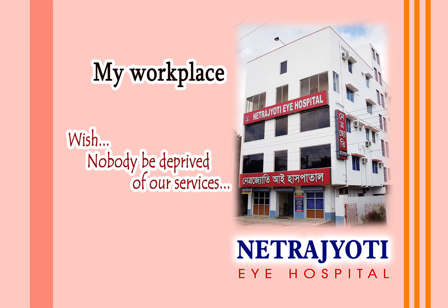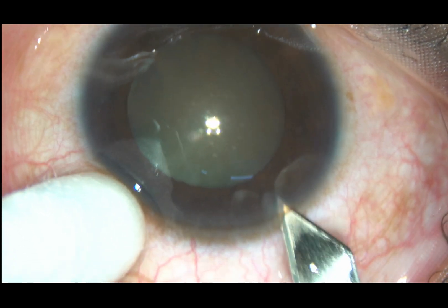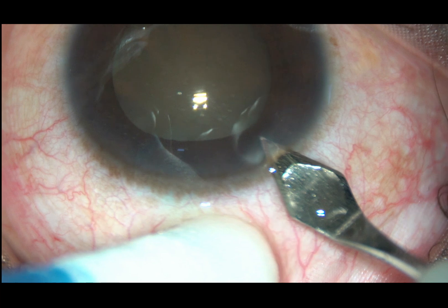Diabolic people — small pupil — become an issue during nucleus management in this case. Let us see what happened and how I managed the case.